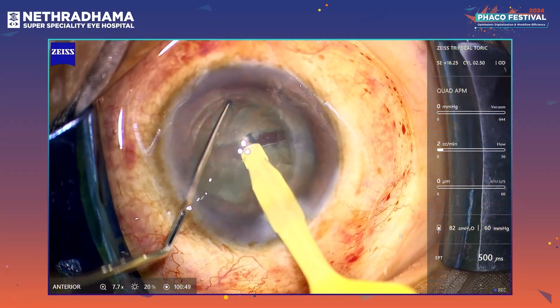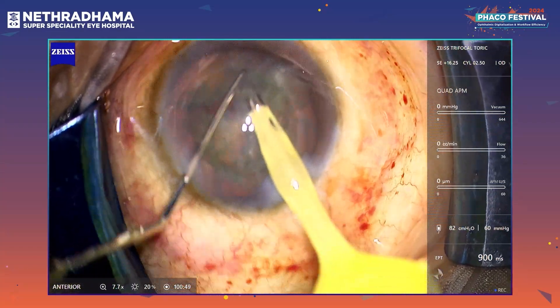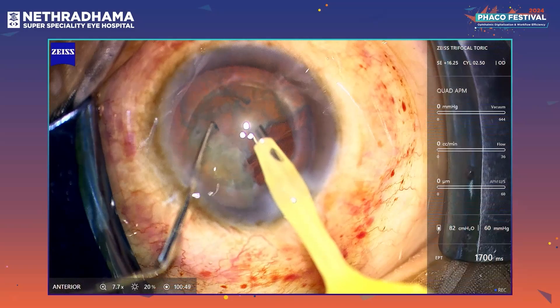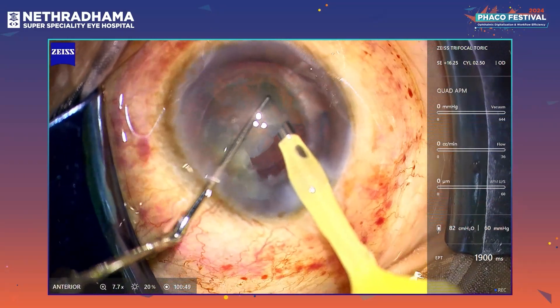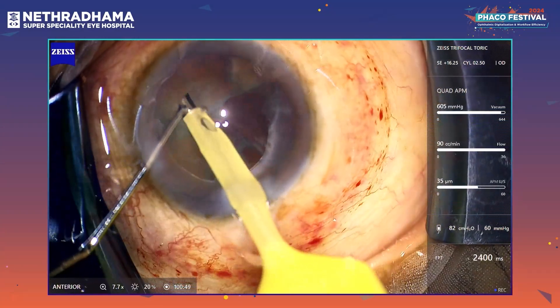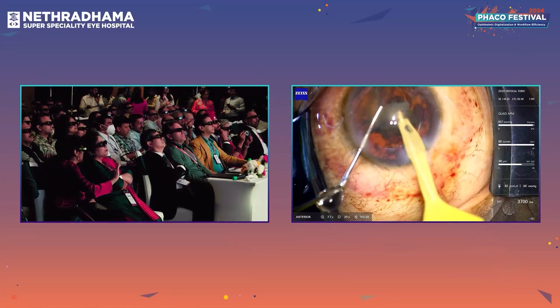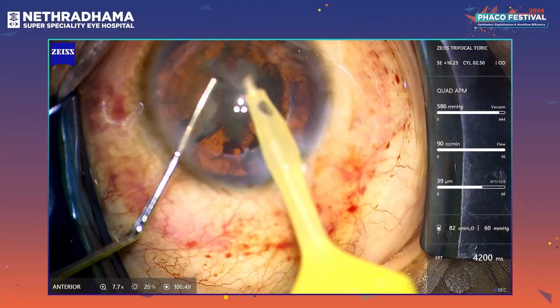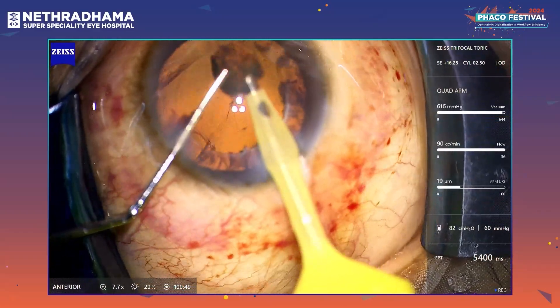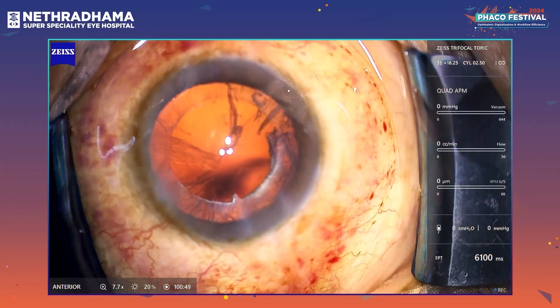Just rotating the nucleus and going for the second chop — very nice chop. This machine has a Quatero pump with two chambers for irrigation and two chambers for aspiration, and the fluidics are very balanced. There is minimal surge or any anterior chamber fluctuations. The chamber is quite rock solid and I am able to easily remove all the pieces with minimal phaco energy. That's the nucleus management; we are moving on to the IA.